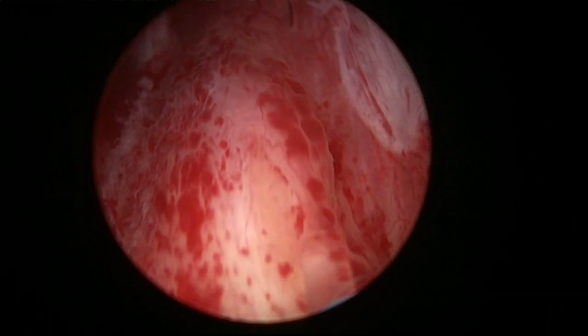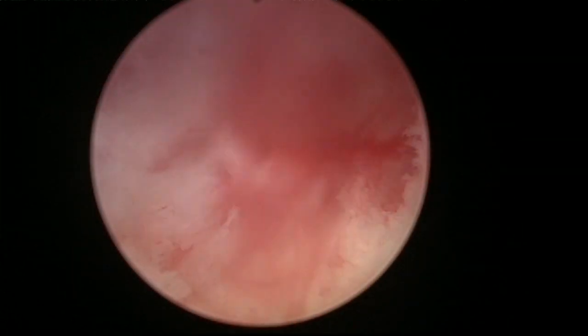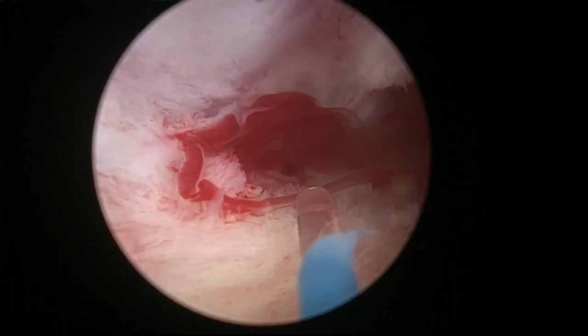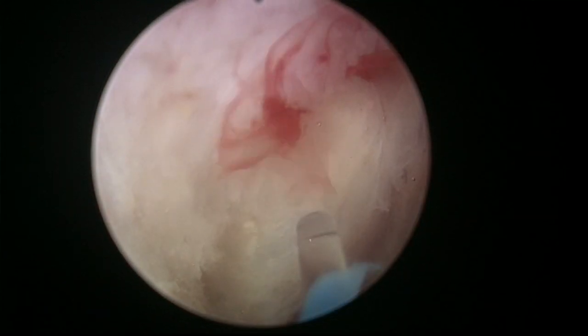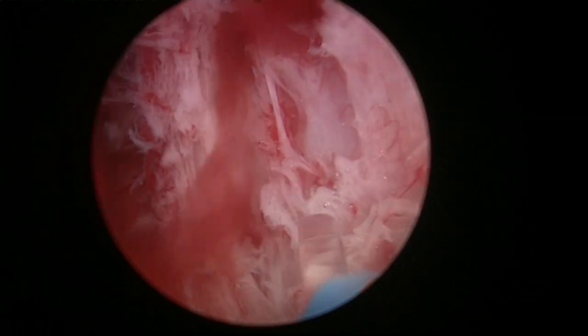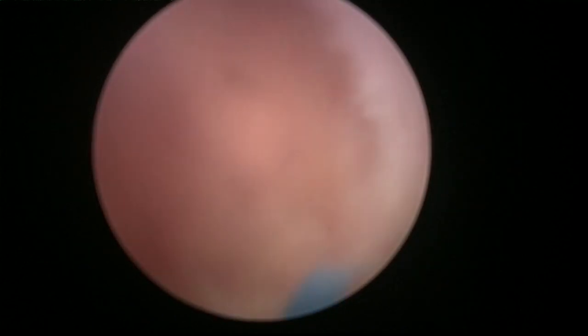But let's go into the plane. So this is the veromontanum. So here, you see, if you push a little bit with your scope, you're going to enter the proper plane very easily. Let me cut and coagulate here. I want to release the attachments of the sphincter to the adenoma from 6 o'clock to 9 o'clock on this side, and then on the other side, I'd like to do the same, just following the white line.